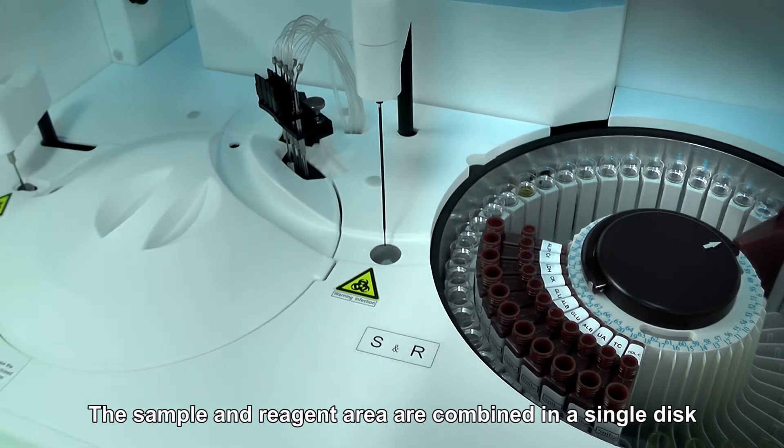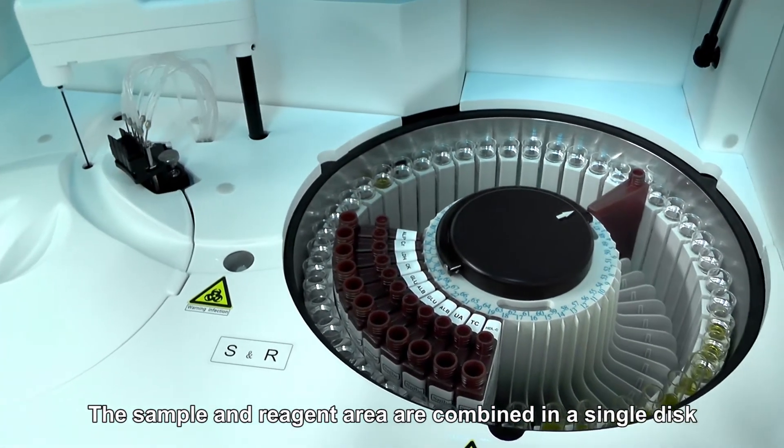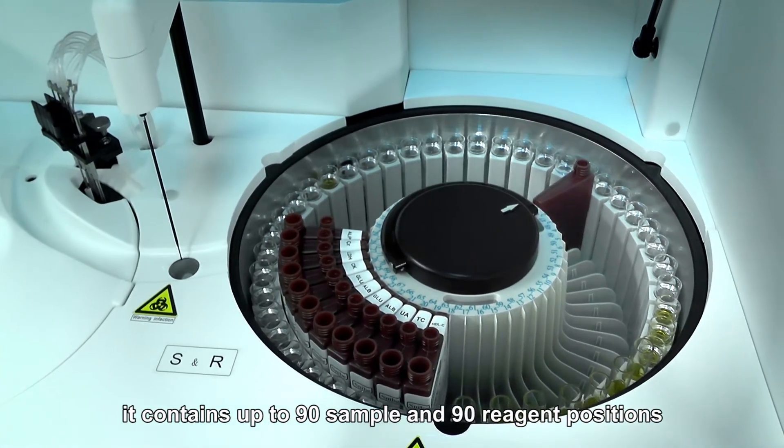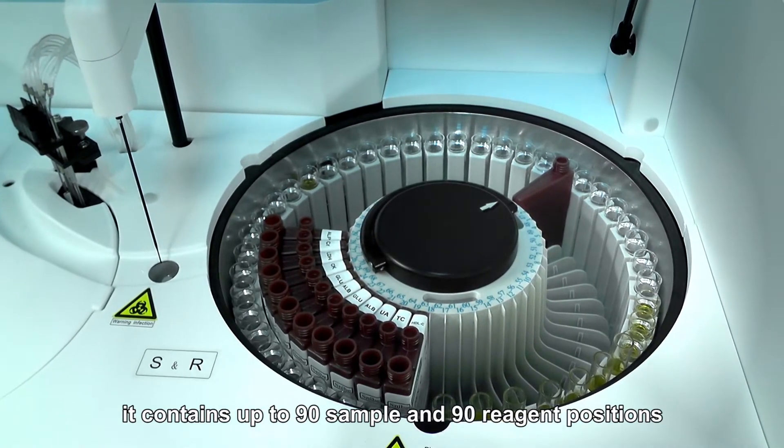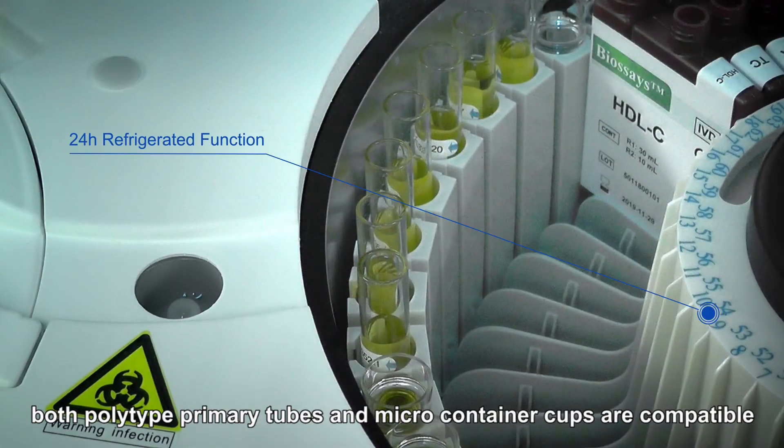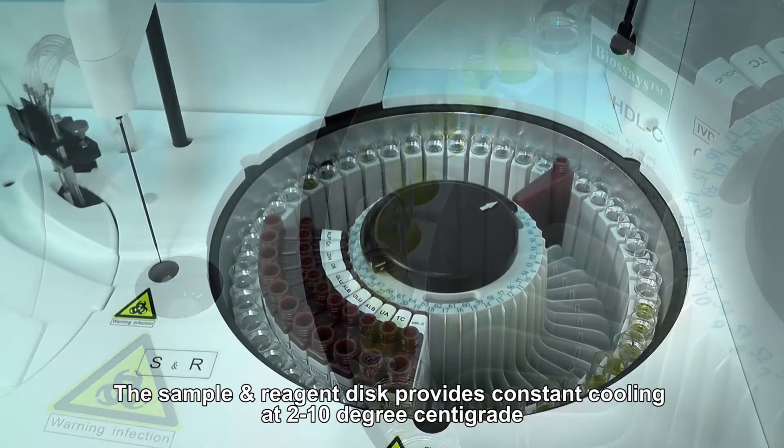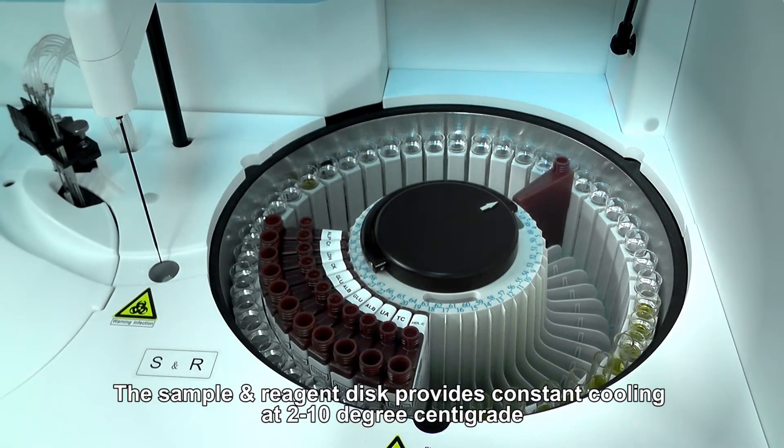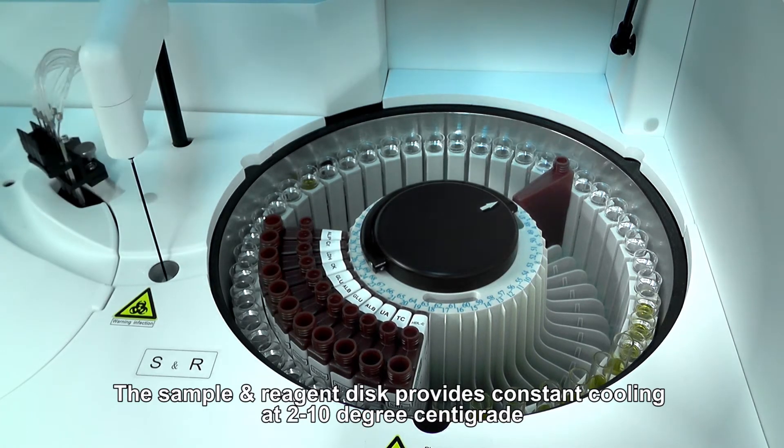The sample and reagent area are combined in a single disk. It contains up to 90 sample and 90 reagent positions. Both polytype primary tubes and microcontainer cups are compatible. The sample and reagent disk provides constant cooling at 2 to 10 degrees centigrade.